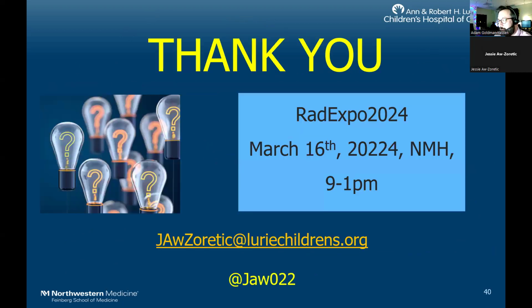And are you doing ASL on all of these cases also? No, it's variable, I think. Not at that women's hospital yet, but we have been revamping our protocols.